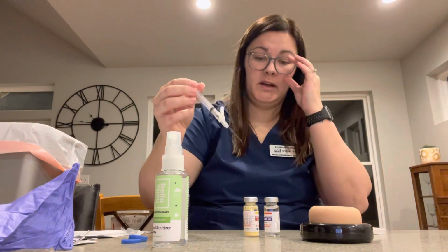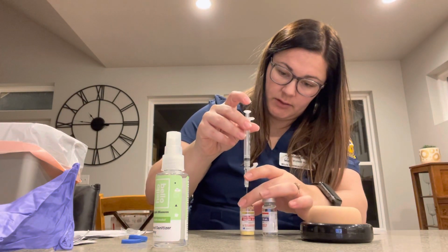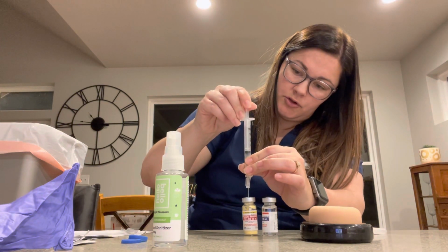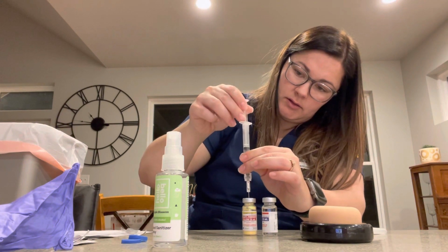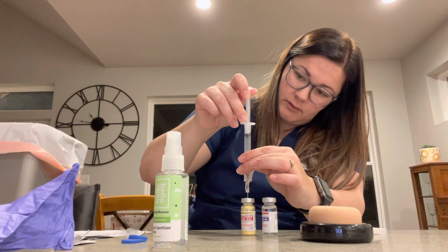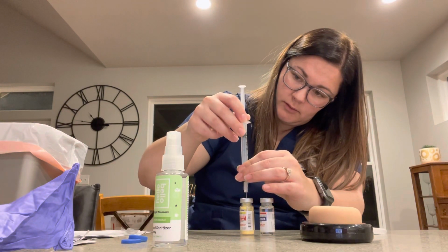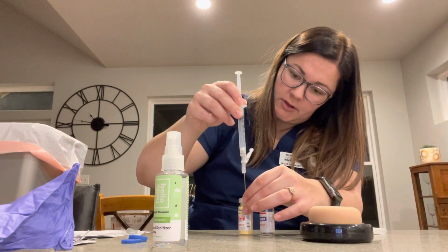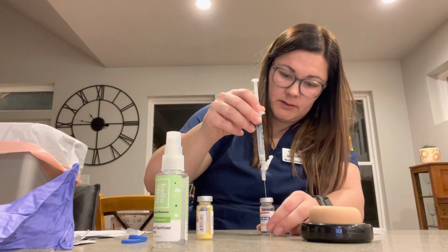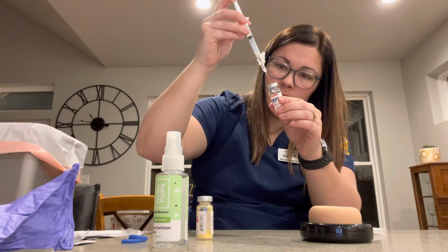I'll start by removing my needle. I will insert it into the medication vial and withdraw 2.8 milliliters of air. I will then withdraw this from the vial. Place the air in the diluent, making sure not to get any in the liquid.